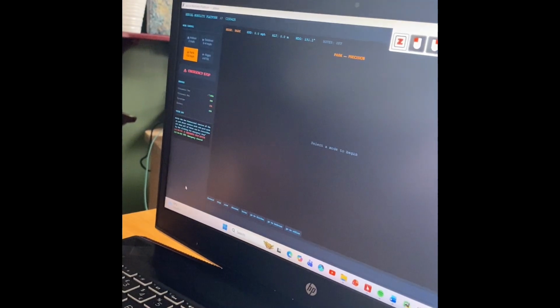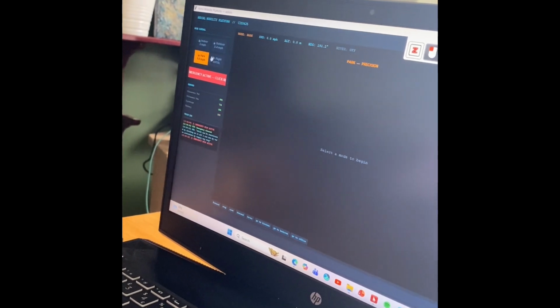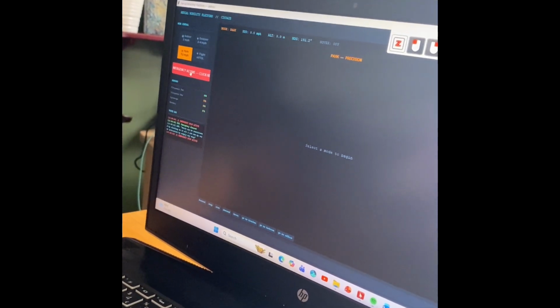All of these can be overridden by either clicking the emergency stop, which can be reactivated by clicking on it, or I can use my voice activation by simply saying stop. And you can see the emergency stop is activated.